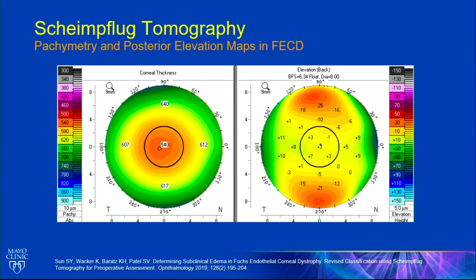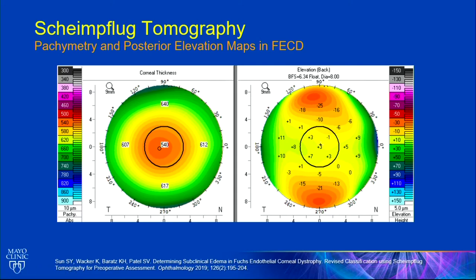These are the tomographic maps from the Scheimflug imaging device, shown here for a normal cornea. The corneal thickness map is derived from the elevation maps of the anterior and posterior surfaces. A normal corneal thickness map has circular or very slightly oval isopacks — lines that join points of equal thickness — that are pretty concentric and parallel to each other. The thinnest point of the cornea should be central or very slightly infratemporal. The posterior elevation map is quite homogenous in a normal eye, with no obvious abnormality.